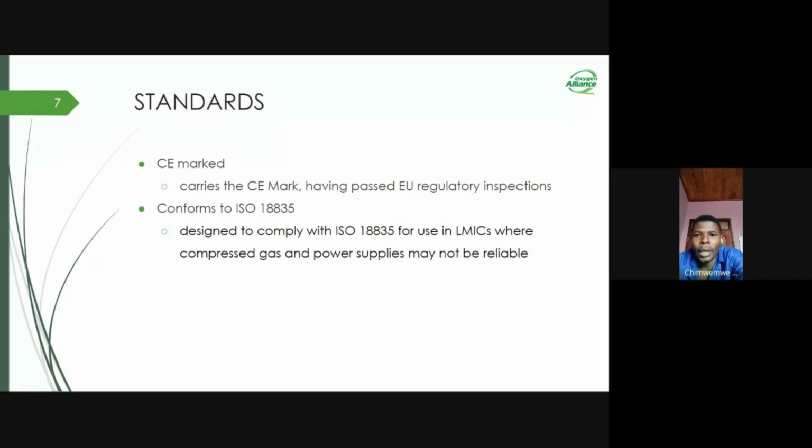One thing that has to be noted is that this machine was designed specifically to adhere to ISO standard 18835, which is for utilization in low and middle income countries where compressed gas and power supply may not be that reliable. So it can work in situations where you don't have reliable power supply and also when you don't have compressed gas. My colleague Foster Sentala will explain better about this.